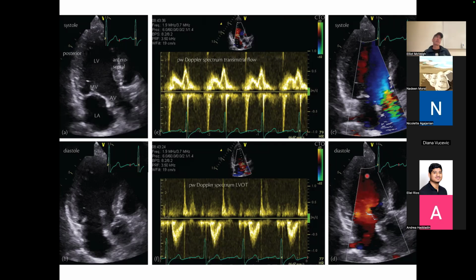So it's not like this. This is just physical. How fast is that thing moving? That's what you're measuring. And so MRI can also do that. MRI can look at an aorta, for example, and say, how fast is the blood moving in the aorta? And it will give you a number. Okay, but it's different than functional MRI.